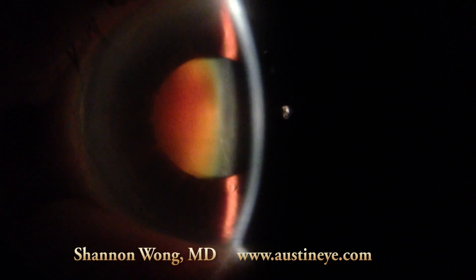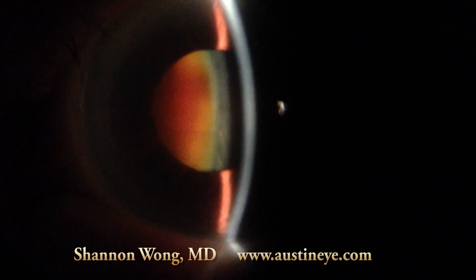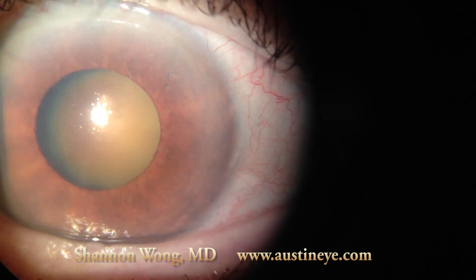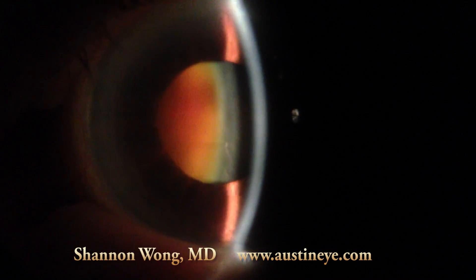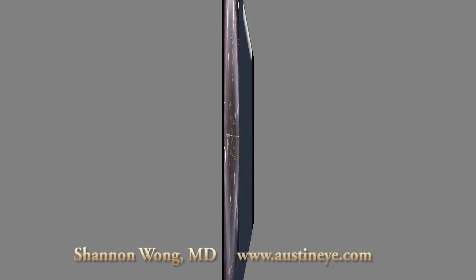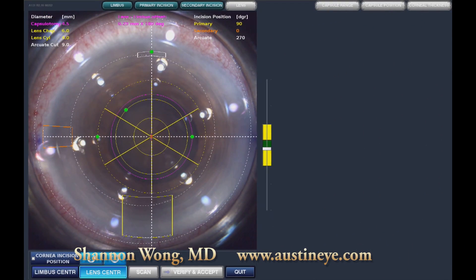Hi, this is Dr. Shannon Wong. I'm an ophthalmologist at Austin Eye in Austin, Texas. I'm going to demonstrate use of the LensX Femtosecond laser on a very dark brunescent — what I call root beer — cataract. The patient is 87 years old and has what I would describe as 4-plus nuclear sclerosis, which limits any view of the retina.